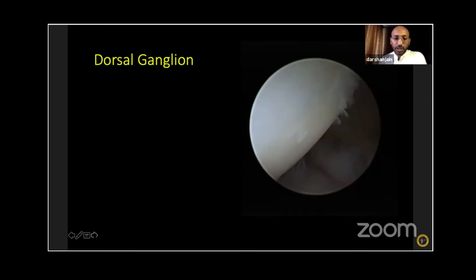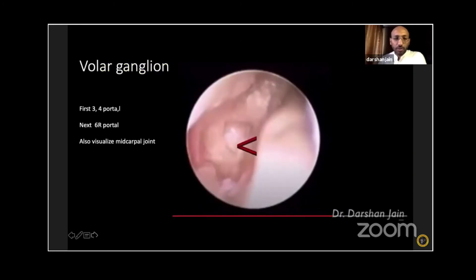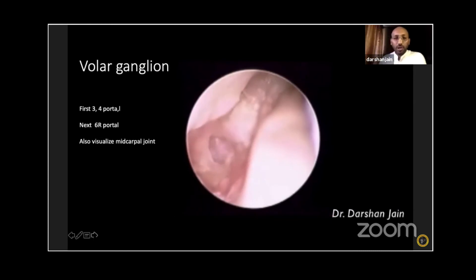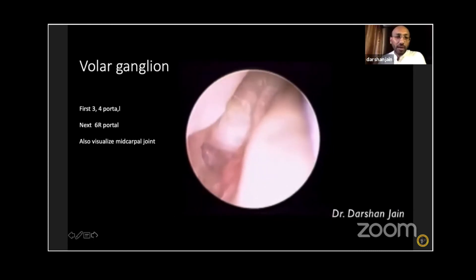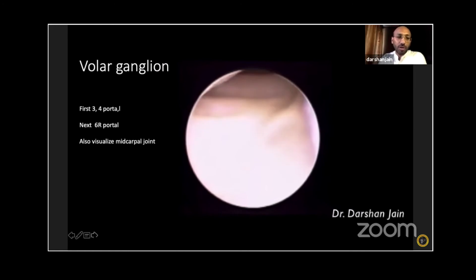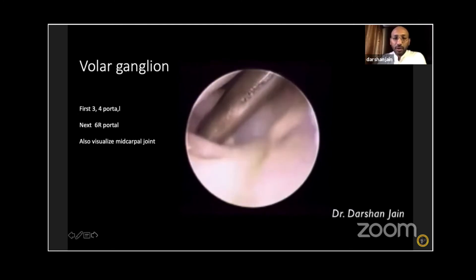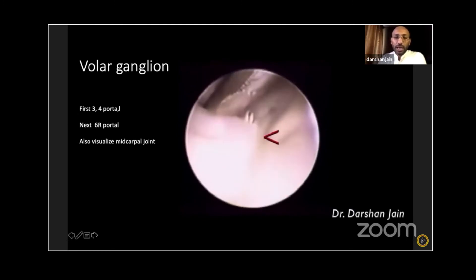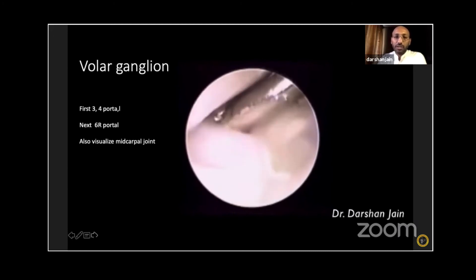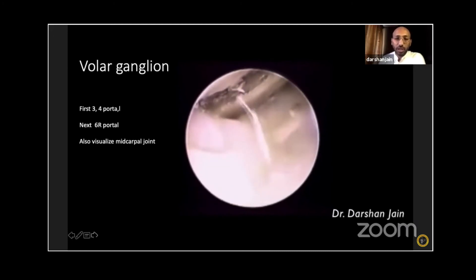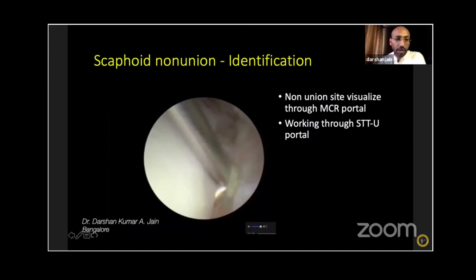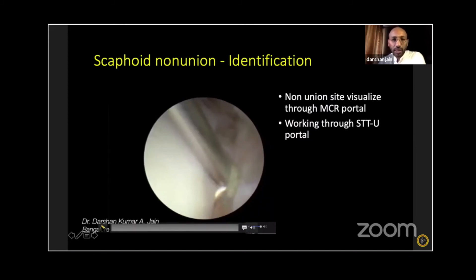About one centimeter of capsule is removed. For volar ganglions, it's best done with dry arthroscopy — establish the 3-4 portal, then the 6R portal. Dorsal ganglions are more difficult to do dry whereas volar ganglions are easier. Once the cyst is opened and working through the radiocarpal joint, you can identify the scaphoid. The next condition is scaphoid non-union.